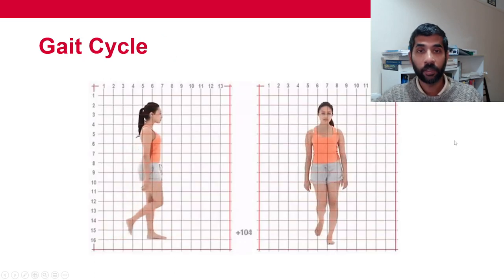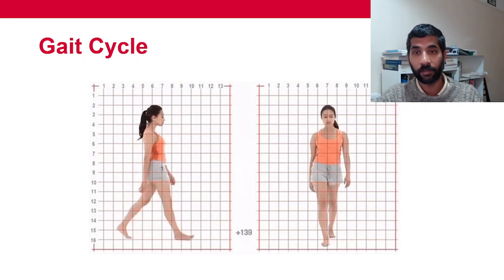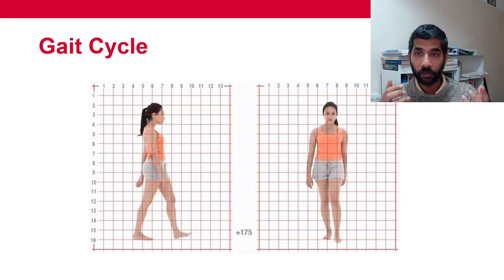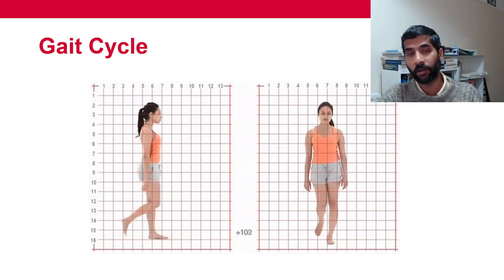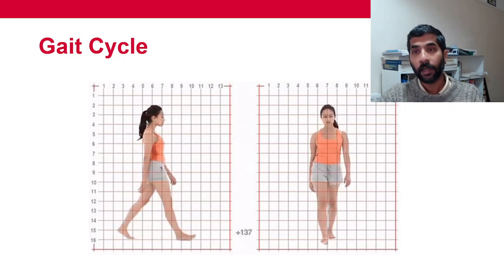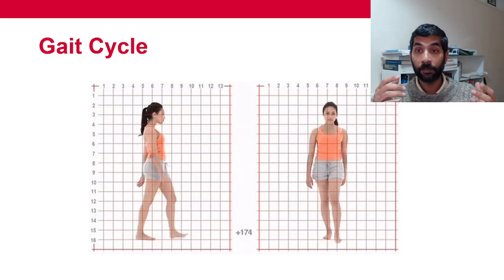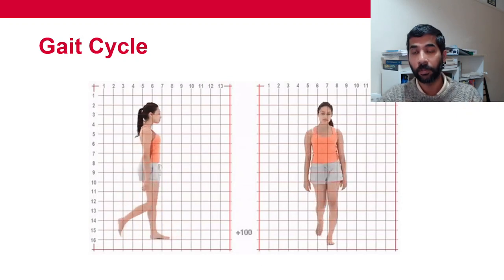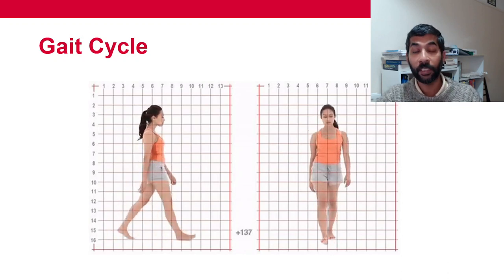Okay, so you can see this lady walking, and somebody has shot a video of it, and clinicians will be able to look at this gait and they will be able to say, well, the gait is fairly normal, or there is some issues with this gait. Okay, and of course, a very trained clinician will probably be able to look at a patient and be able to say what's wrong, and will be able to prescribe some measures to overcome the problems that is happening.